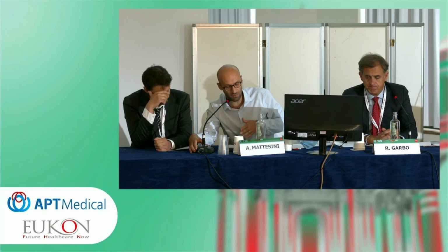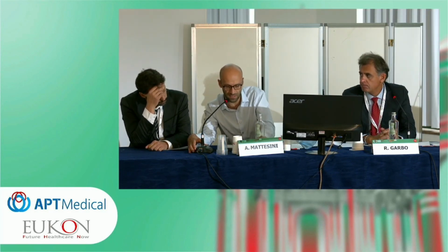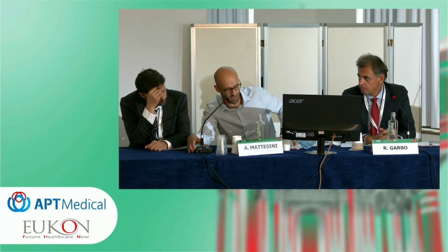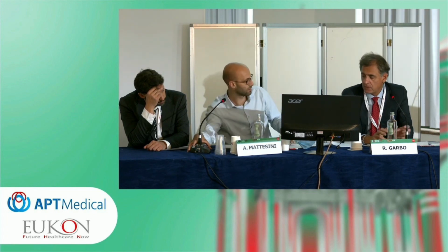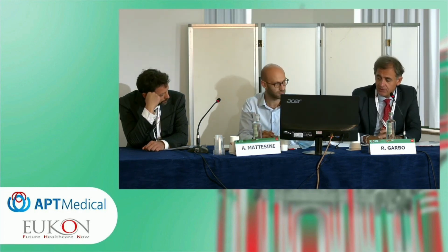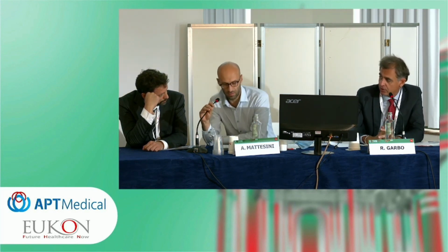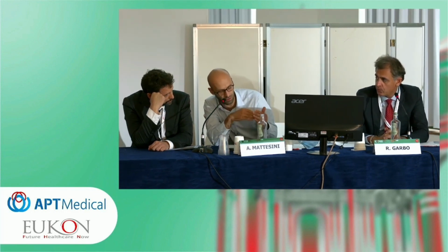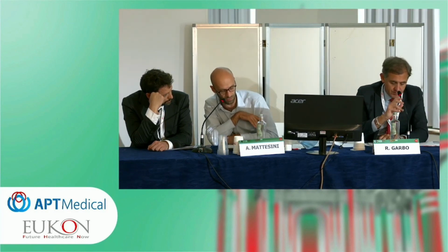Same thing when you have to recross a side branch. I don't have much experience yet, but perhaps in some very tortuous and calcific vessels, this shape of the balloon can really help to go through the vessel. I think we need to try, because the profile is good and these features are really interesting. This spheric tip can reduce the friction in the calcified lesion. Also in calcified lesions, I can imagine that when you have some speckles, you get stuck with normal balloons, and with this one, perhaps you're able to track the vessel.